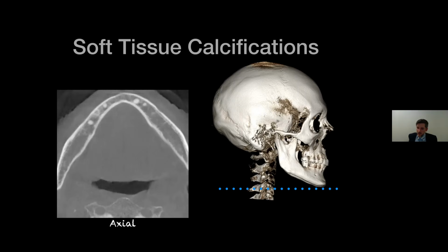And someone, a Planmeca rep, did say 3 microsieverts for ultra low dose 3D pan at low res. Yeah, so that is less than a regular pan for a small field of view scan. Before this, I was talking to my wife about dose. We don't normally talk shop, but she's a pediatric dentist and was really interested.